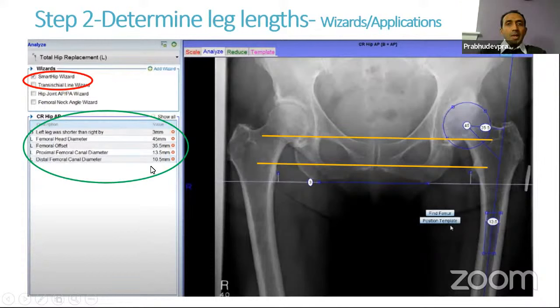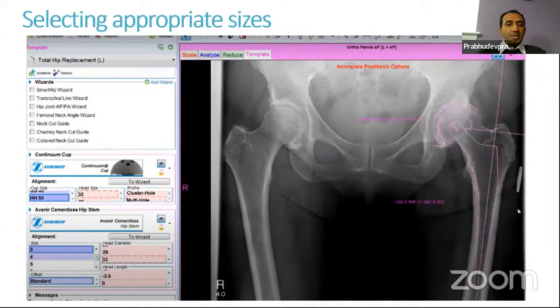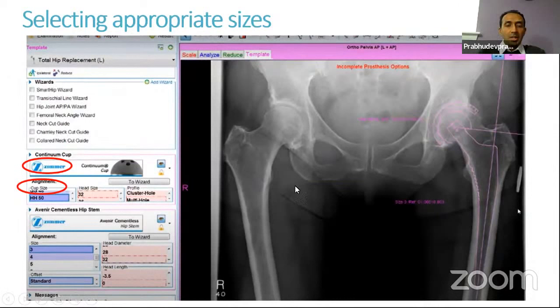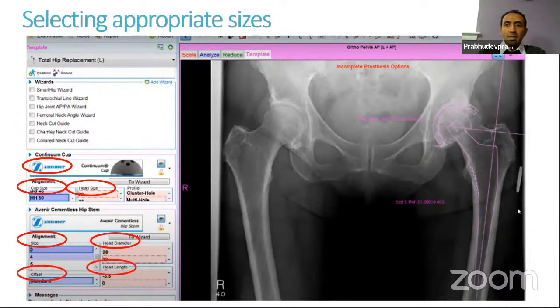Then you click on Template and the software automatically brings in the acetabular cup and stem, which you can move around. You select the company you want — you need all the different company templates loaded into the software. The software initially selects sizes based on the information you've given, and then you can move the implants around and change sizes: the cup size, head size, stem size, head diameter, offset, and neck length.